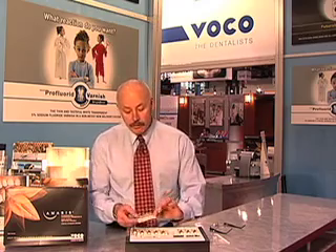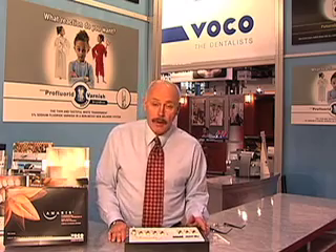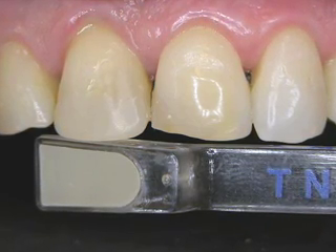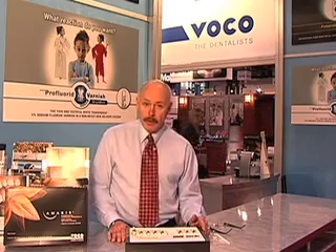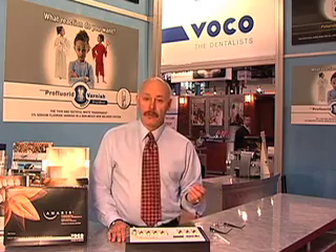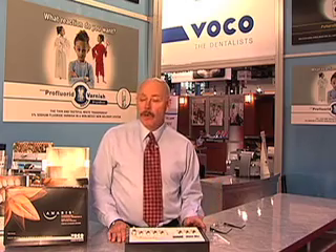After you complete your adhesive protocols, you pick your best opaque shade for the base of the preparation — whether it's opaque one, two, or three — and layer this up to the dentin-enamel junction. Then you take a look and see if you like what you see. If the color is compatible with what you feel the enamel layer will be, you put a translucent neutral enamel shade on top, light cure it, and what you see is what you get.